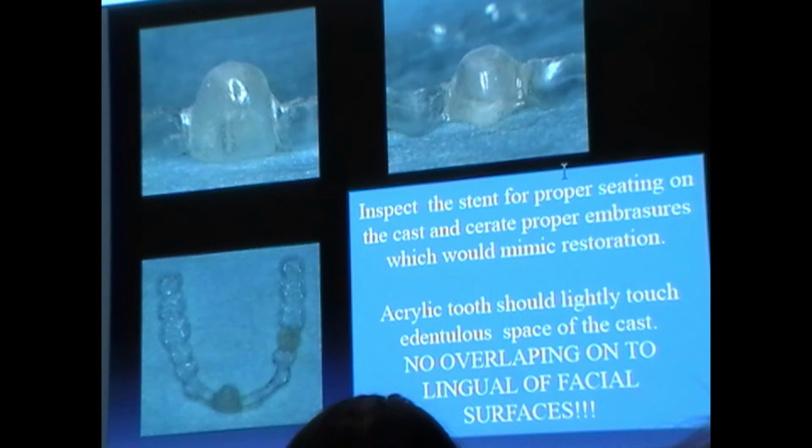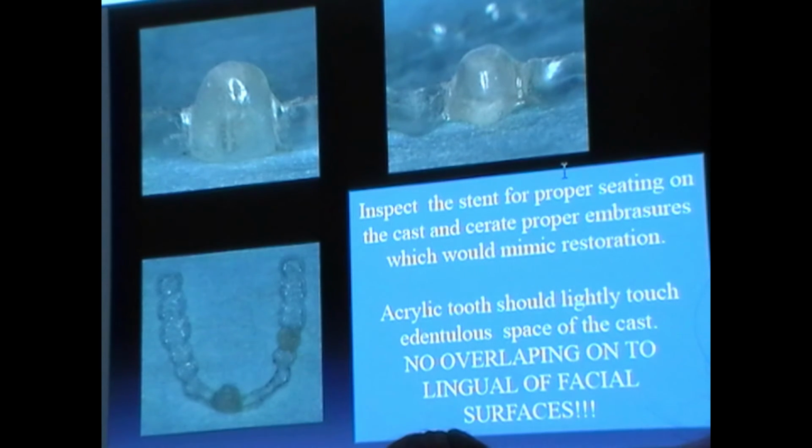Here at the School of Dental Medicine, you are required to present your case to Dr. Porto. He approves it. It gets assigned to a department, either oral surgery or perio. You take that guide to the surgery, and you are to be there during the surgery, and you are to see the surgeon utilize the guide you have fabricated, or a guide that you and Dr. Porto have agreed to be fabricated by some type of source.